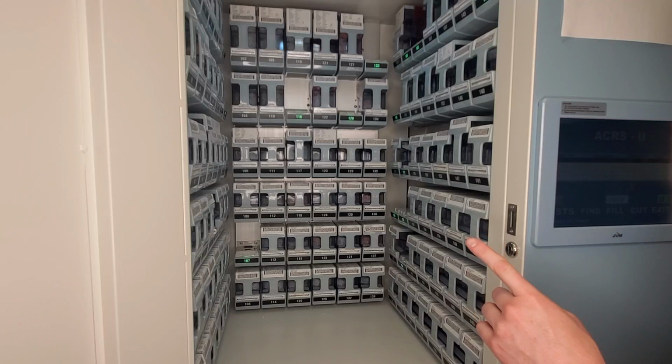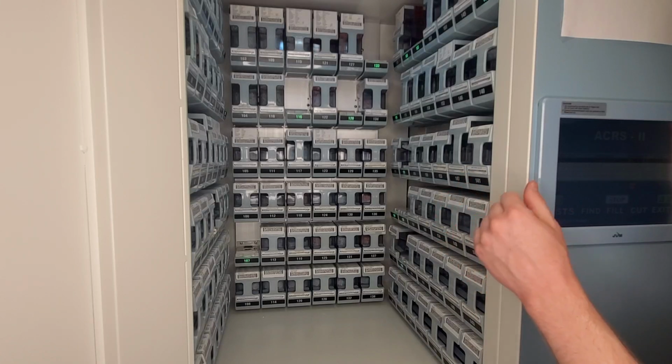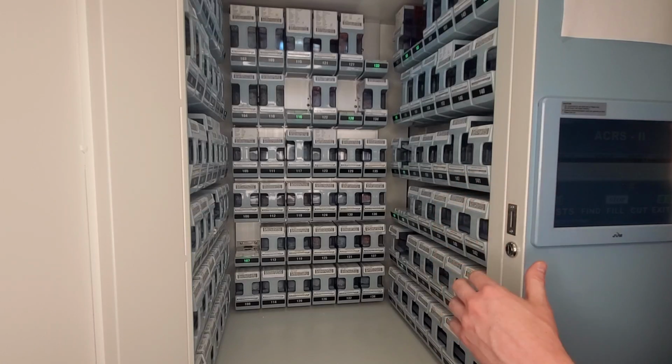Now, one thing to note about canister jams, canisters empty, or anything like that: when you see that error on the machine, you should come and investigate the canister before you press continue, because it makes it a lot harder to dispense and to see what you dispensed if you do that before you fix the canister issue.